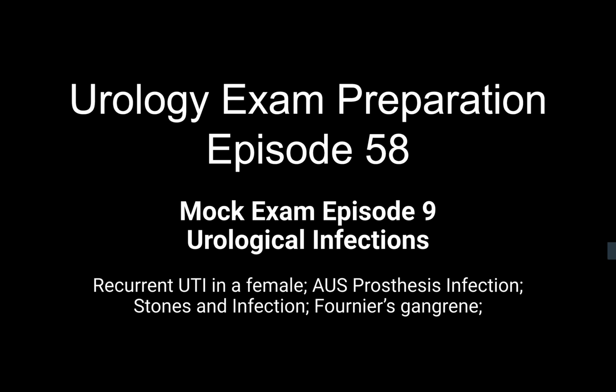The available ones are from Coloplast. The types of implants could be malleable or inflatable. Inflatable could be two-piece or three-piece. I'm aware that two-piece inflatable implants are not very much used these days, so three-piece inflatable implants are in common use. What do you mean by malleable?